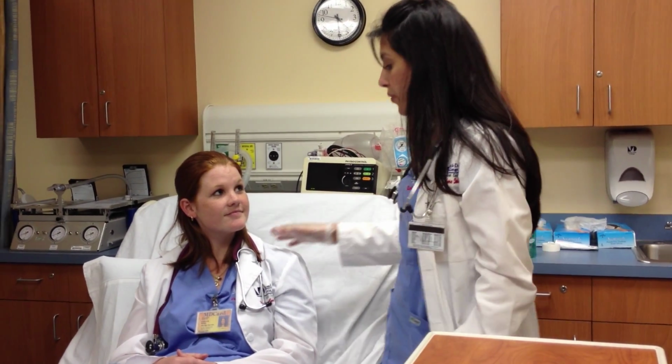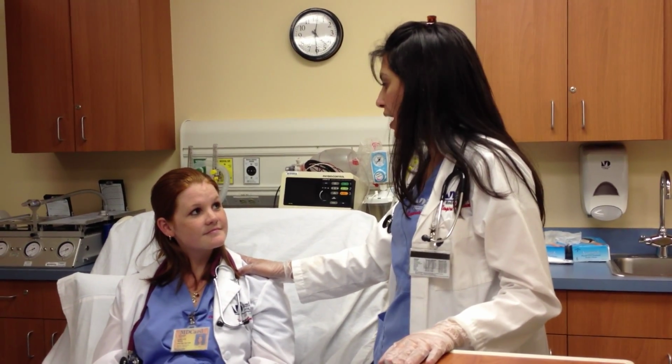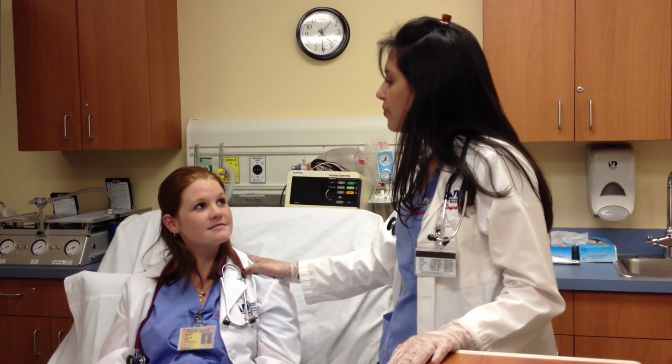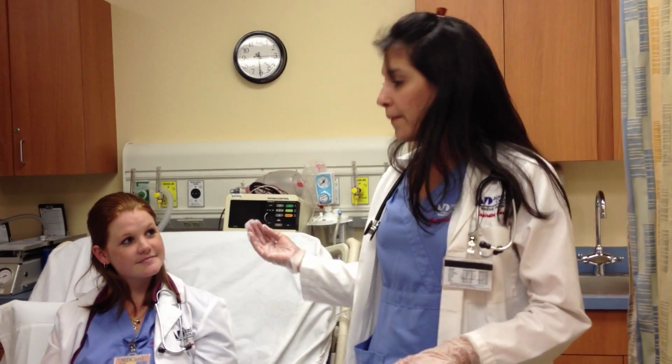Yes. Perfect. Make sure that you motivate your patient and reinforce your patient for using this breathing device to prevent lung complications like atelectasis. Krista, do you understand why it is important for you to use incentive spirometry after your surgery? Yes. To help my lungs. Perfect. You think you could do this 6 to 10 times per waking hour? Yes. Thank you, Krista.